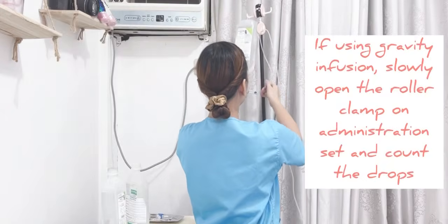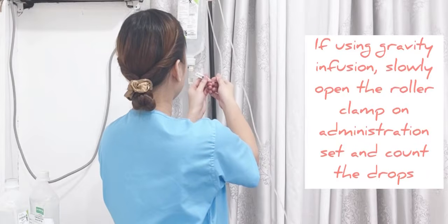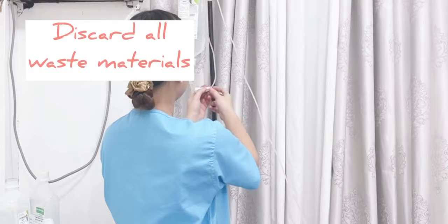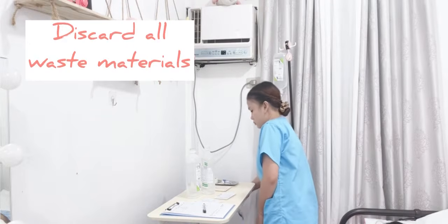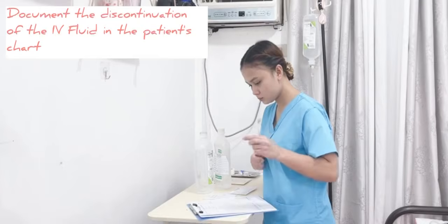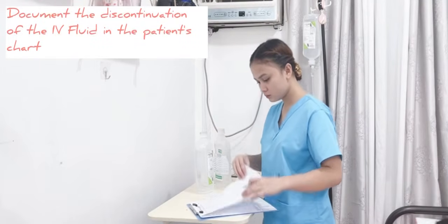Then slowly open the roller clamp on the administration set and count the drops. It maintains measure to restore fluid balance and deliver IV fluid as ordered. Then discard all waste materials used according to hospital policy, as it reduces risk of infection. Then wash hands to reduce the transmission of microorganisms. Then lastly, document the discontinuation of the IV fluid in the patient's chart.